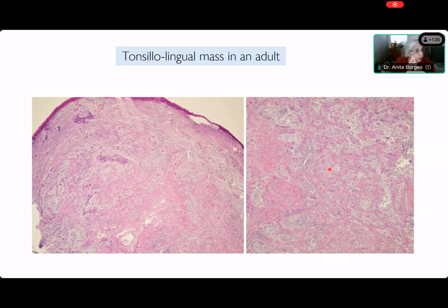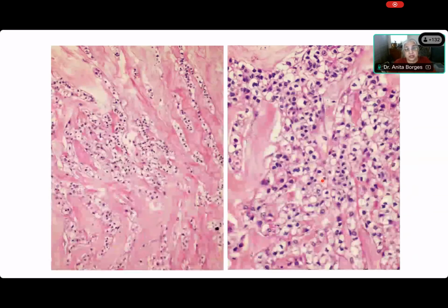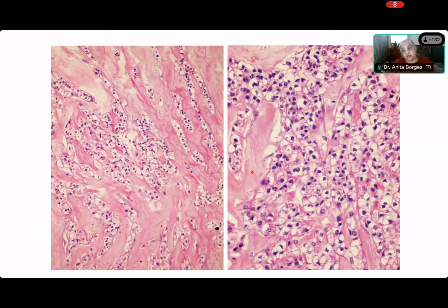All right, Akshara, will you explain what is a beam? It's an architectural term, no? Haven't you seen that when they're building buildings, they put up the beams and then the walls come up supported by these beams, and that's what you're seeing. You are seeing interconnected beams or trabeculae over here. This is a trabecular pattern, and you can see that. Look at this. You see this trabecular pattern, like how you see in a hepatocellular carcinoma.